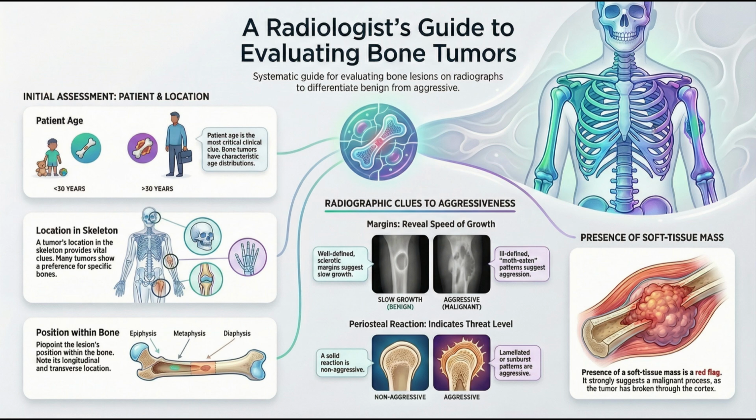Which is why you have to combine everything. You have to. All 9 factors, age, location, and the 7 radiographic features before you settle on a diagnosis. So how do radiologists bring all of this highly visual, very detailed information together into a structured, actionable plan? We started by talking about the X-ray as the primary blueprint. The final piece of that is the ACR Bone-RADS V2023 system.